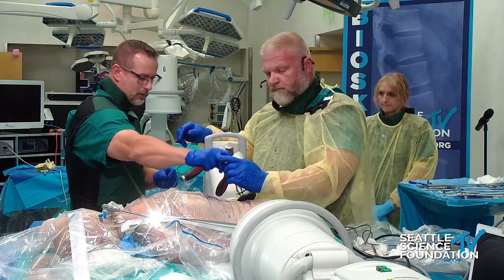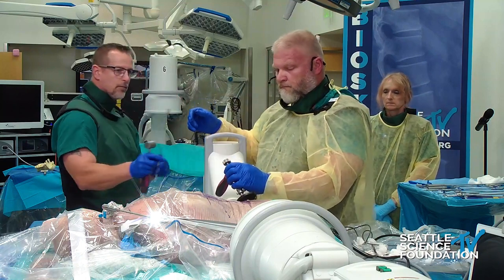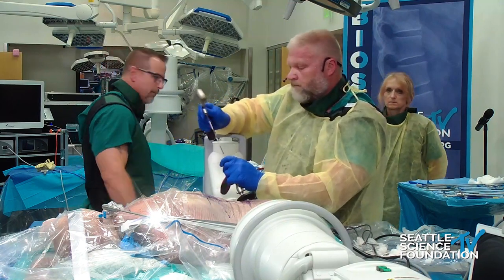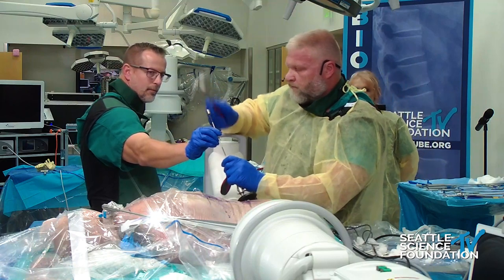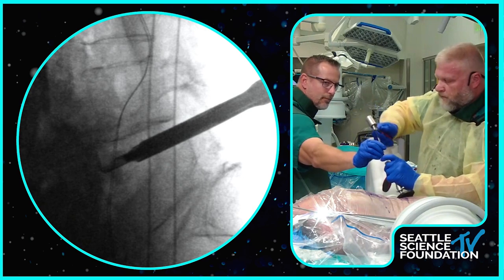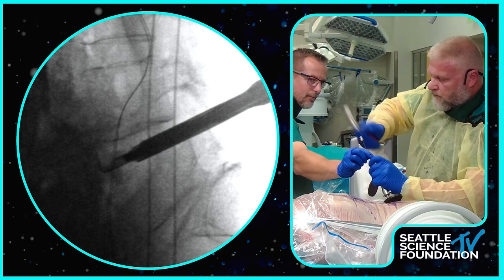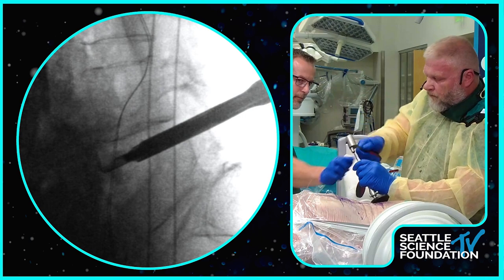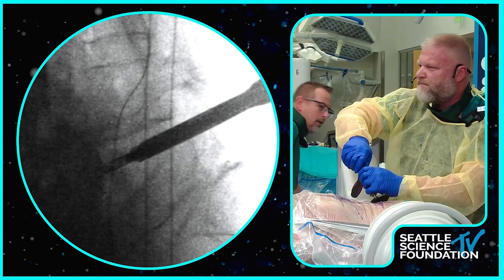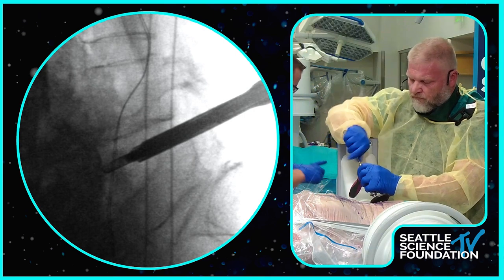The percutaneous instruments are really aggressive, and like Dr. Jian Shen said, they can be overaggressive. They really cut into the bone. So typically the way I do it, I do a blind discectomy with all their percutaneous instruments, then I go back with my camera and endoscope, and I clear out with the curettes and drills, et cetera. Then I might do one more brush at the end, and usually when I'm done, I can see bleeding bone on both sides, so I know I got the cartilaginous end plates. I think this specific system is nice because it's specially made for the endoscope. You can actually plug in an endoscope fairly easily. So that's one benefit of this system.